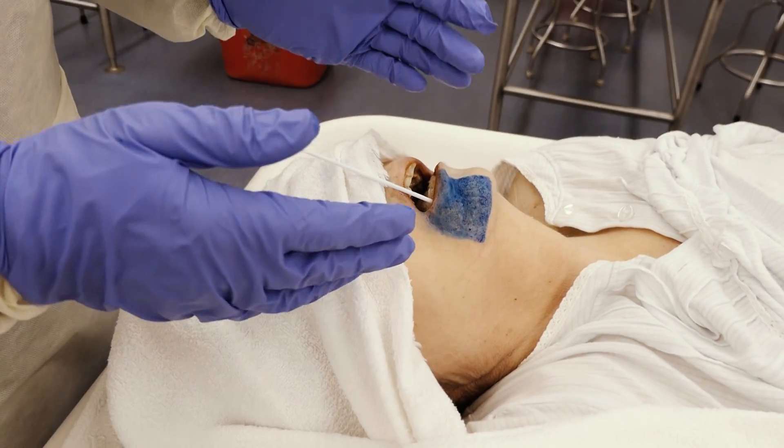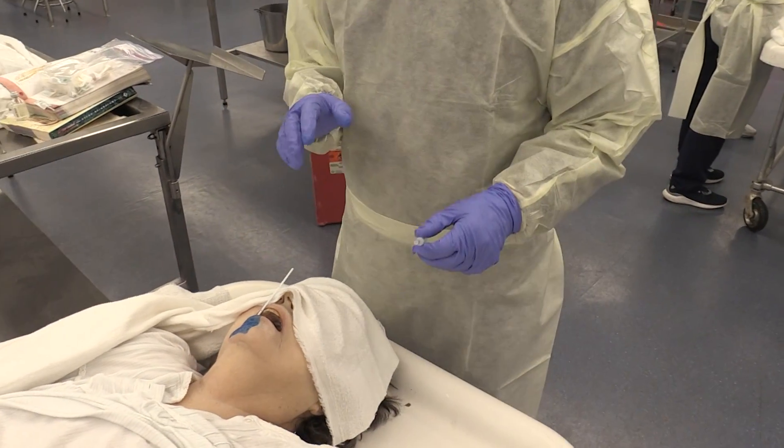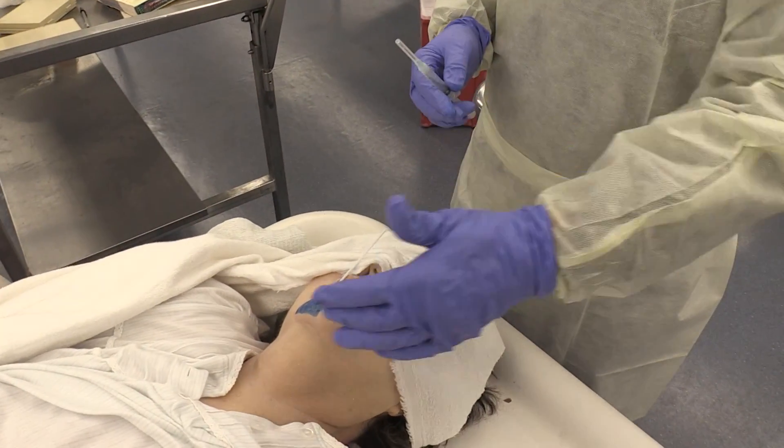The color with the washable ink demonstrated here shows the proximal area where, once you numb up the nerve, the anesthesia will take place.